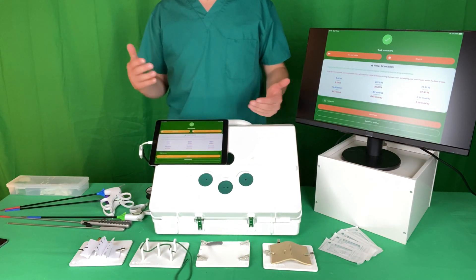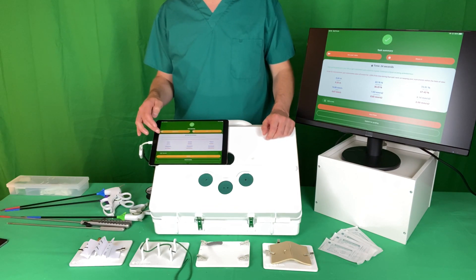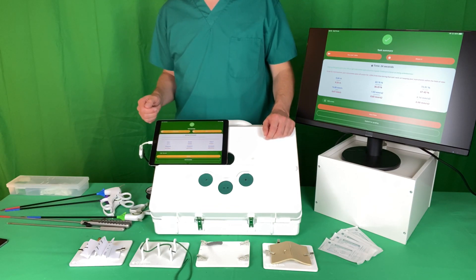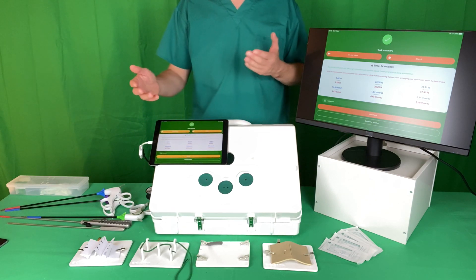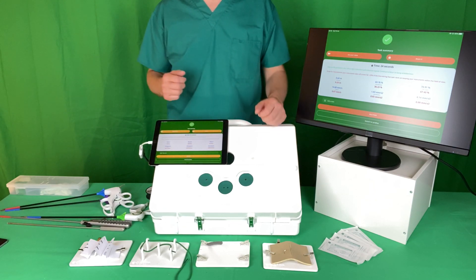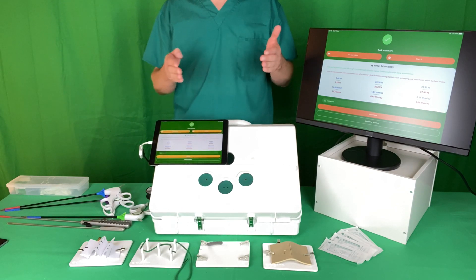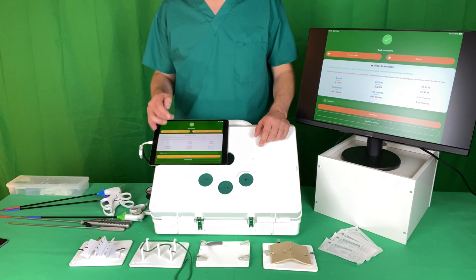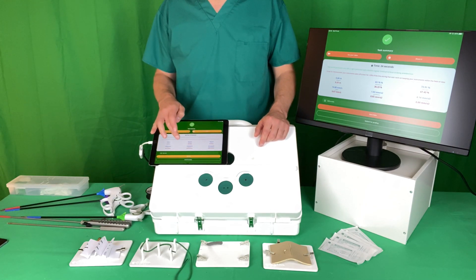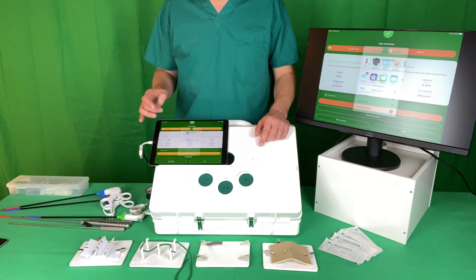The raw numbers will start to mean more over time as you map trends and spot patterns. We also give you some natural language feedback that gives you some pointers to work on — for example, being more ambidextrous if the distance between each hand has been significant, or focusing on keeping your instruments within the operative field if they've been outside it for a long time. You can, if you're particularly proud of your performance, share it with people through the usual routes.